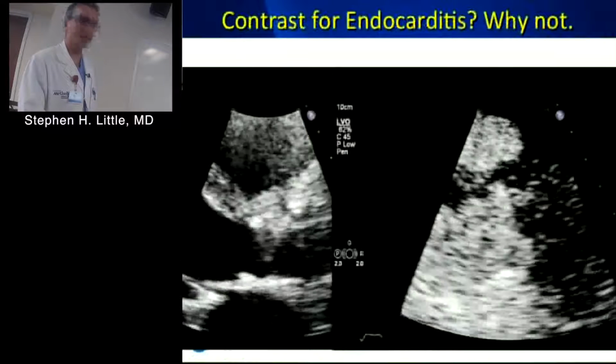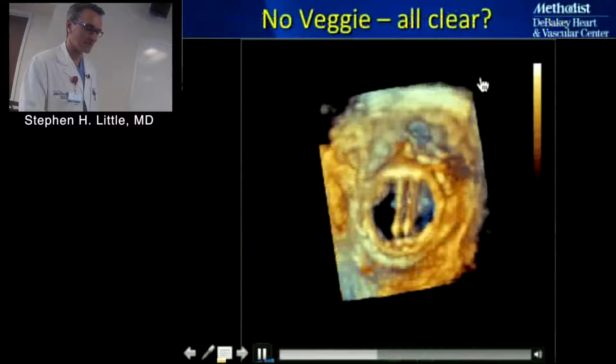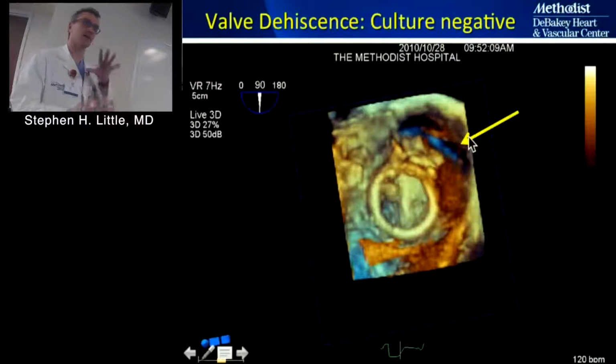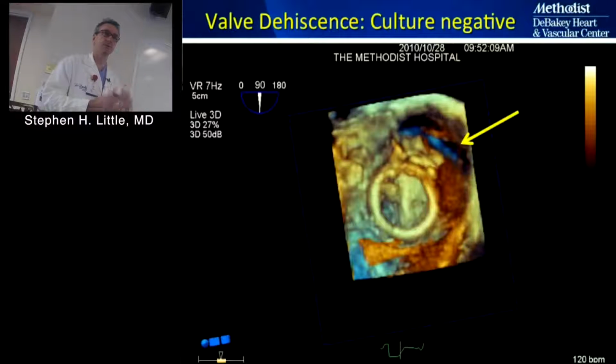So this is a mechanical valve in the mitral position. The defect is really up here. This is a massive paravalvular defect. This is somebody who'd had the mitral valve replaced because of endocarditis, and this is recurrent endocarditis. This patient, unfortunately, was too far gone. He had already had his entire cardiac crux rebuilt by a surgeon and didn't have an option for another one. So he didn't make it through this.